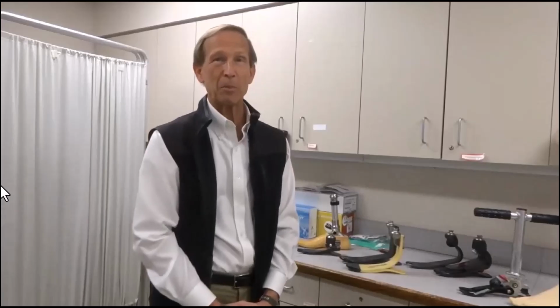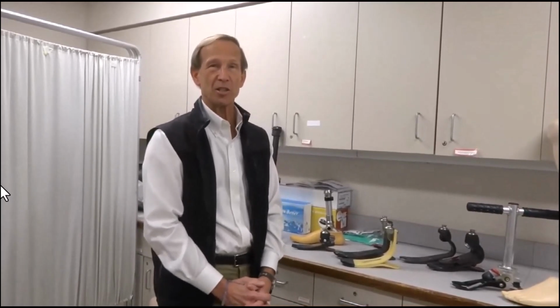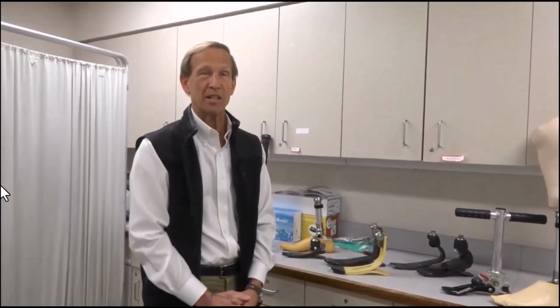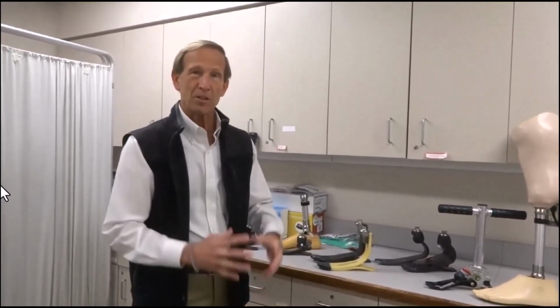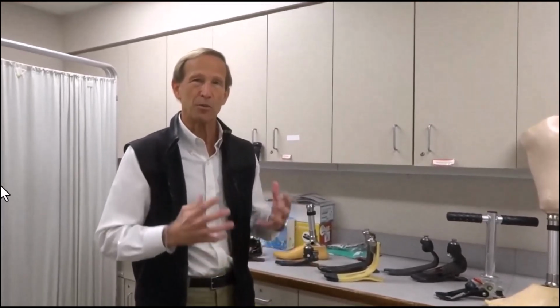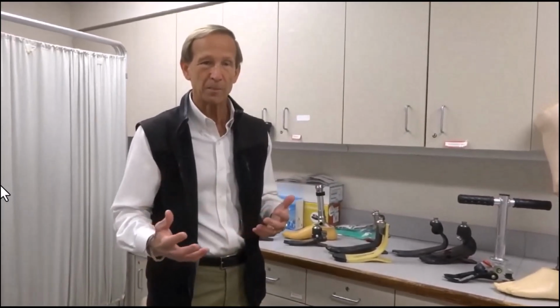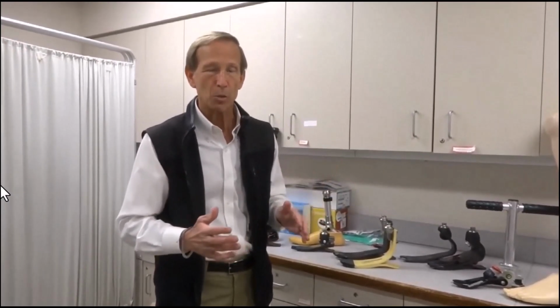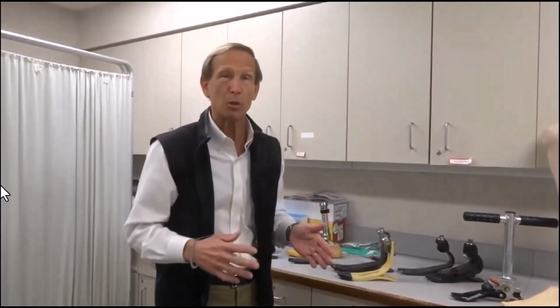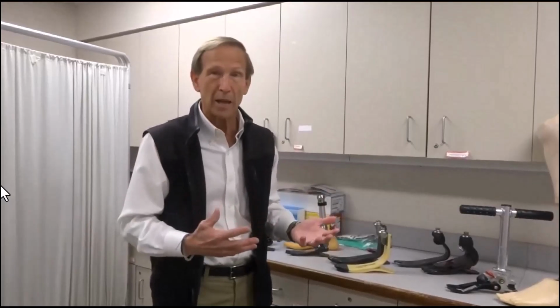So, welcome back everybody. It's Dr. Ustall again. In today's segment of our educational series, we're going to talk about prosthetic feet. So, the foot choice is going to be important for many people because the performance of the foot, whether it tolerates more indoor or outdoor activity, whether it has motion to it, whether it provides a little bit of push that we call propulsion, will make a difference on whether you walk well or walk just okay.